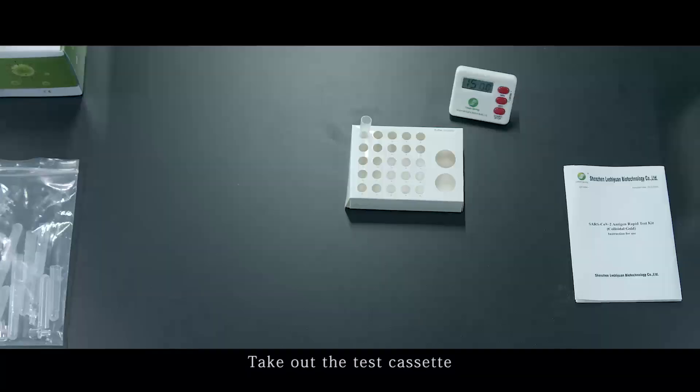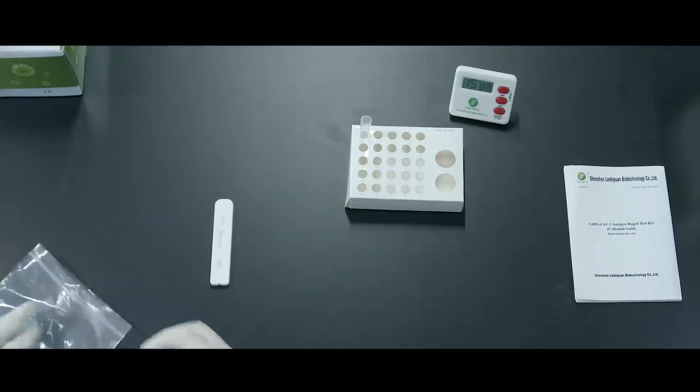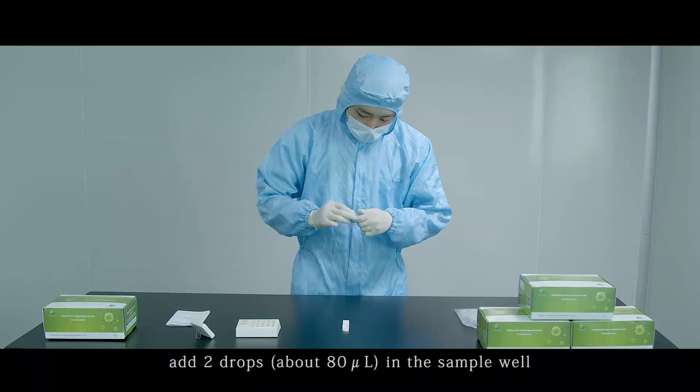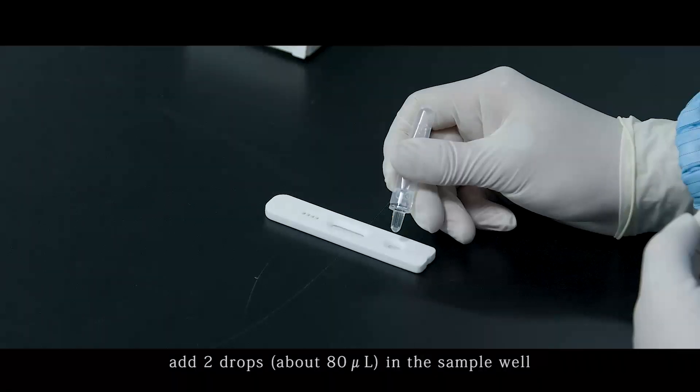Take out the test cassette. Press the nozzle cap onto the tube and add 2 drops — approximately 80 µL — into the sample well.